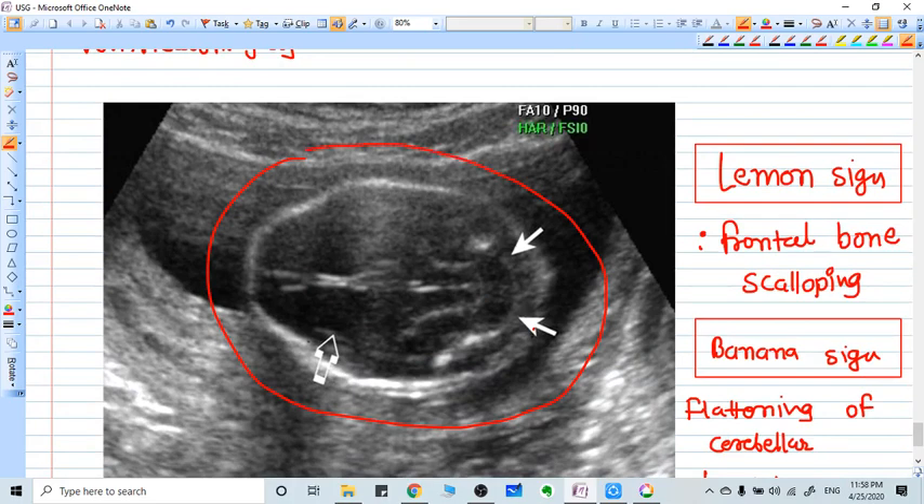Looking at the head of the fetus, you can see the septum pellucidum and ventriculomegaly. The frontal bone is not normal — there is scalloping, so it looks like a lemon.